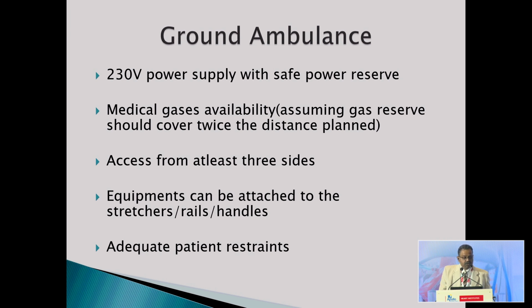Medical gases facility should be available. Always have a reserve of at least twice the amount of the distance planned, or else in between wherever you are traveling there should be a hospital to provide you some cylinders, or a gas filling station should be there in between. And the patient should be accessed at least from 3 sides.